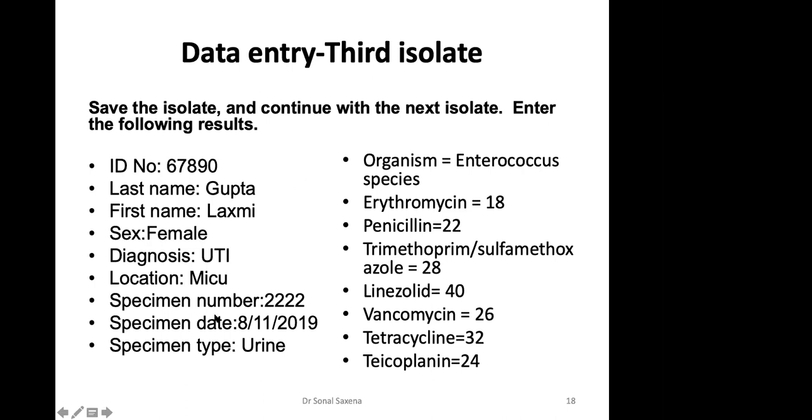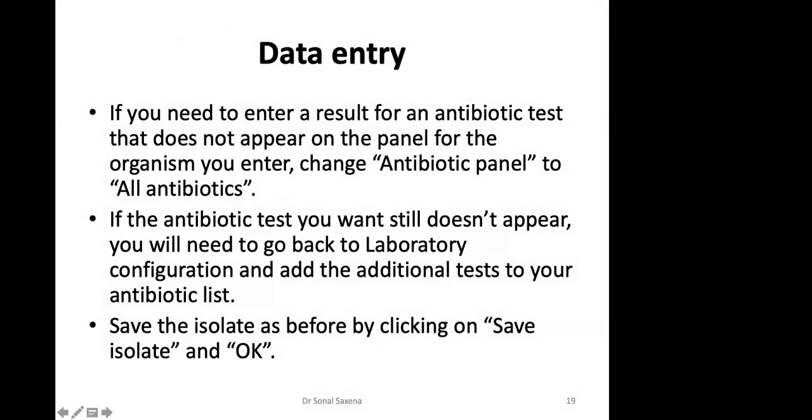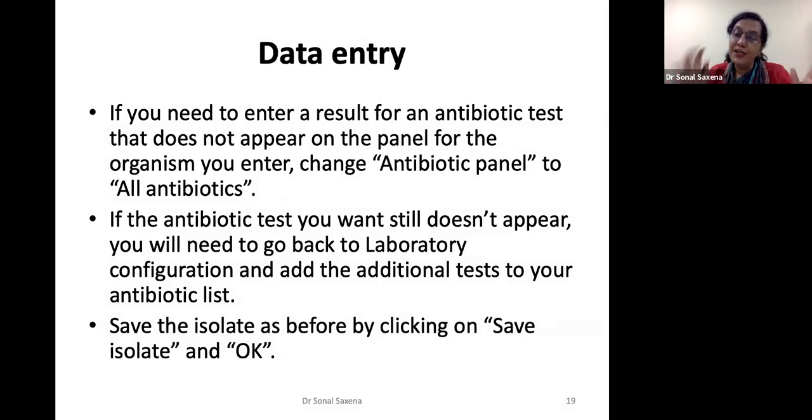Yes. And of course, ultimately, Sonal, recommending a restricted formulary with WHONET in place and following the guidelines, I think it's time for microbiologists to implement it. If you have restricted reporting, you will definitely restrict your prescription formulary. Sometimes the clinicians get riled up saying you've not given a sensitivity, but then you have to talk to them and convince them that your first line is working. Why do you want to give a second line?